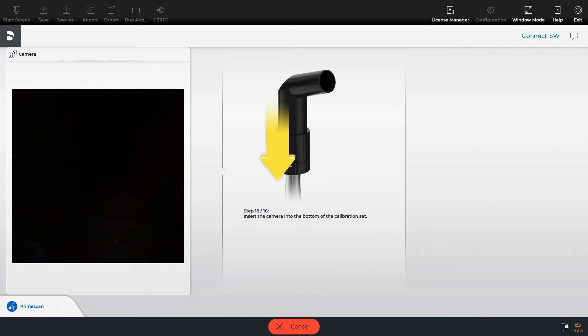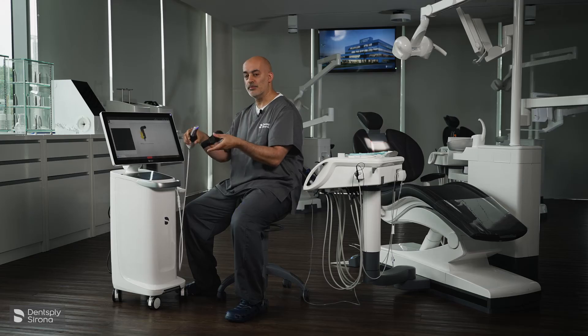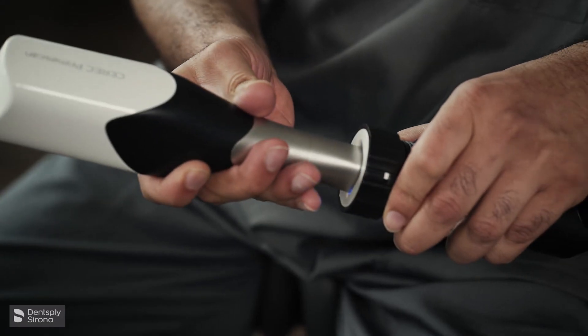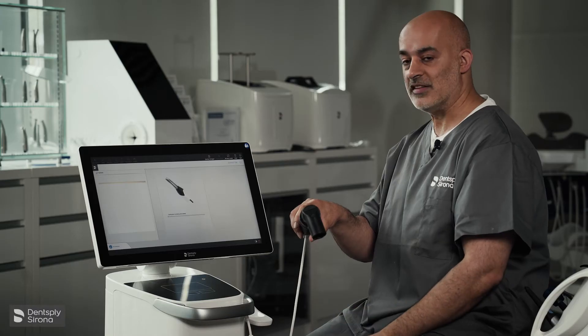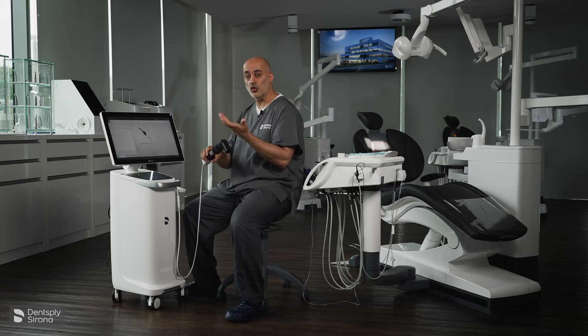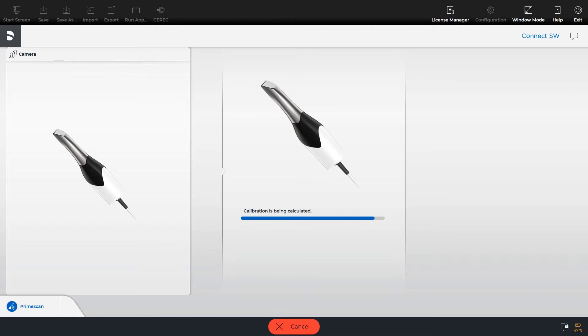Now at step 18, it asks you to insert the camera into the bottom of the calibration set, which is the white part. It's just capturing that last image. It takes approximately three and a half minutes for the total calibration. Just to remind you, this is done once a month for trueness and precision.